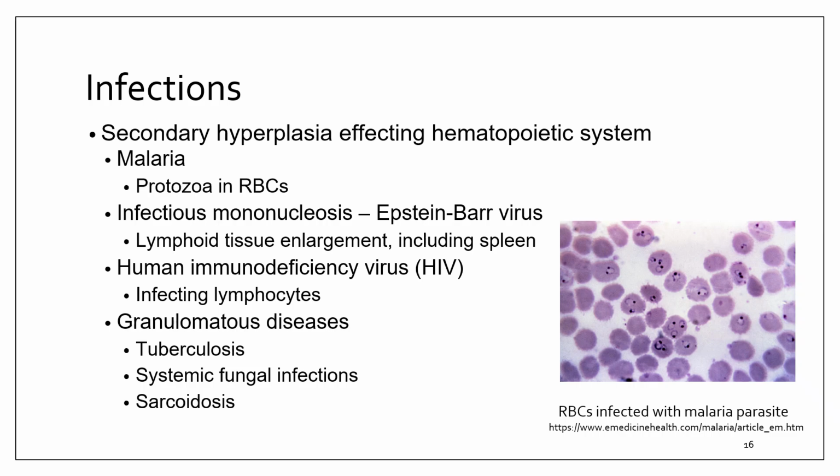to something else? Some worthless but excellent knowledge: malaria parasites digest hemoglobin and leave behind a pigment called hemozoin. Okay? That dark brown granular pigment can sometimes be seen microscopically. Basically, that's parasite poop. You're welcome. You can see that on the image there to the right.